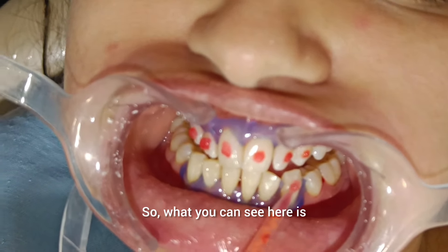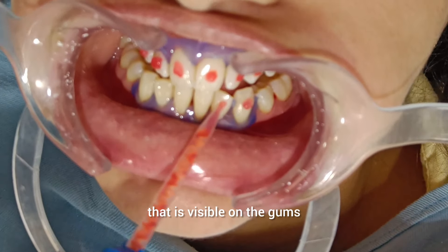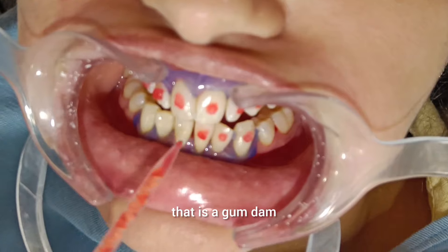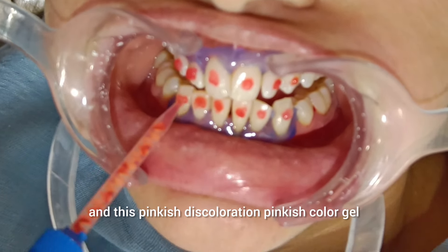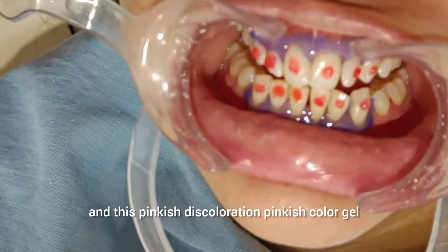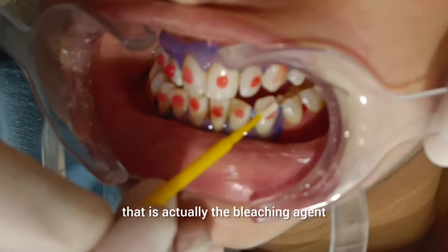What you can see here is that we have retracted her cheek. The gums on the top is a purple color — that is a gum dam, so that the gums don't get harmed. The pinkish color gel is actually the bleaching agent.